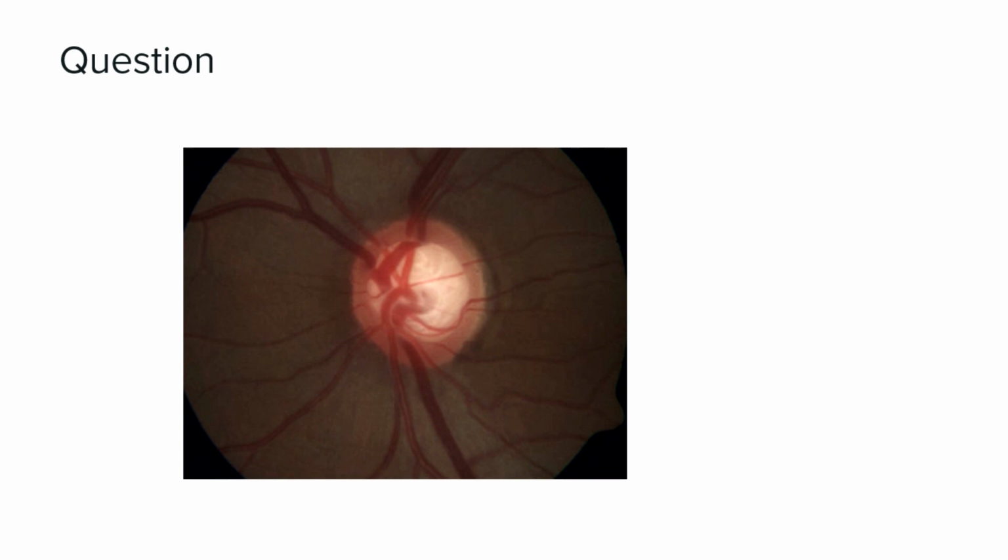Obviously, you need investigations, but this patient you would put down as suspect. But it would suffice to know that it looks more or less normal. If the visual field is normal, you might want to brand this as normal. You wanted to say something?